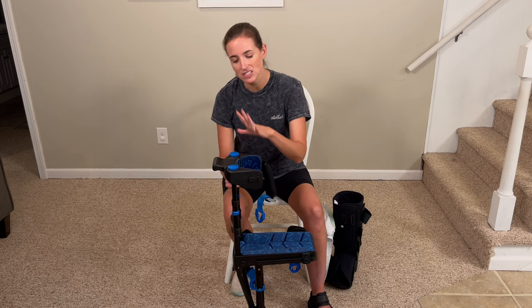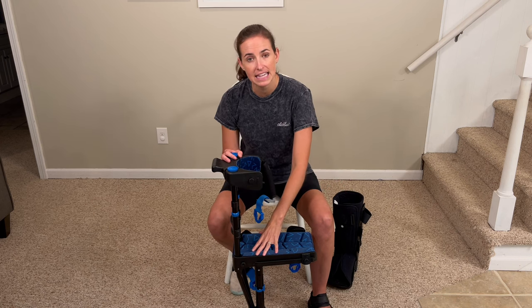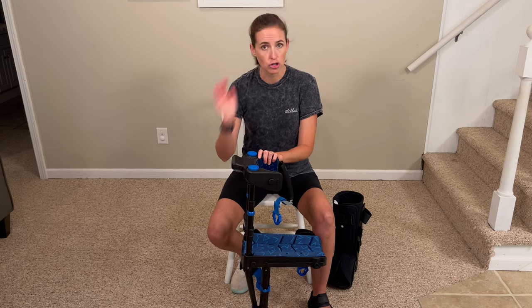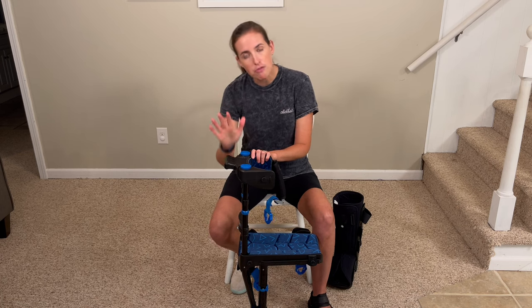They also give excellent directions on how to size this. One of the most important things about using this product is that you get the sizing just right. It needs to be fitted properly at the thigh, properly fitted at the knee, and the right length down below — because if it's off, it's a trip hazard. You could fall. It's really dangerous. So making sure you get that sizing right is so important.